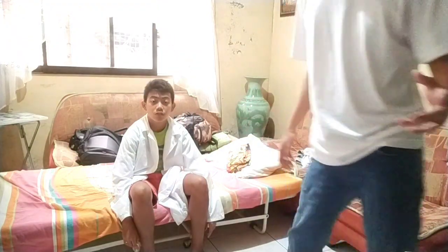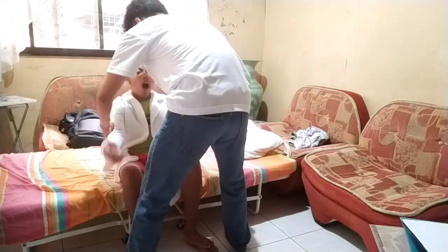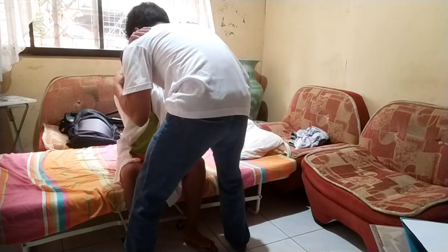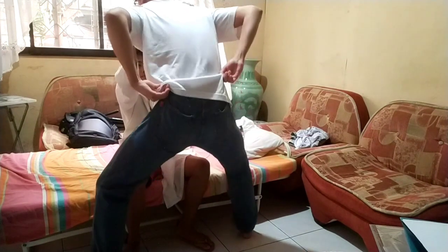So for this, what we're going to do is, sir, let's put your hand on my thigh, sir. Sir, position yourself, stand straight.